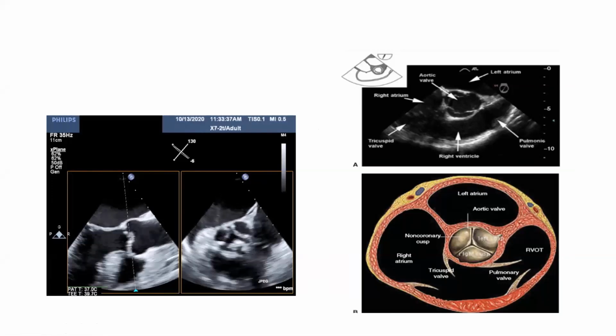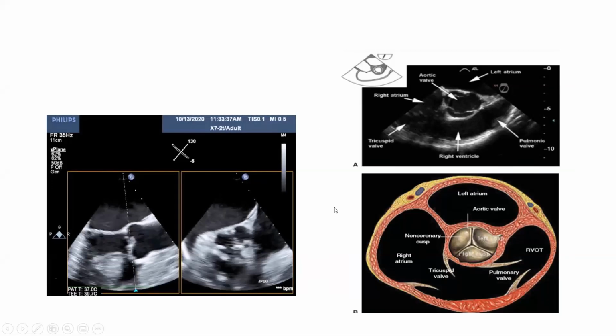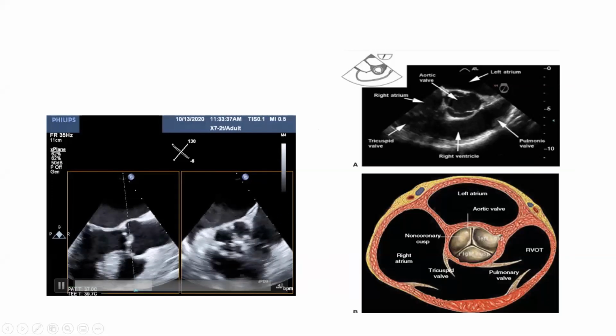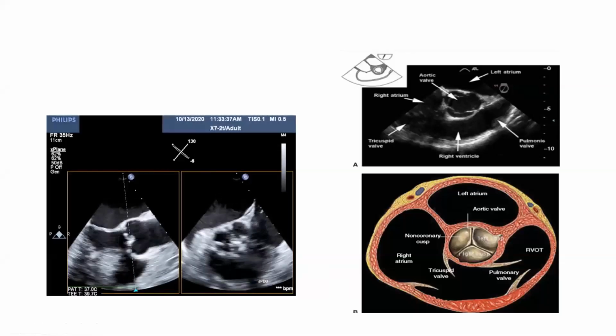You will go to the short axis of the aortic valve. So this is the second way to get the short axis of the aortic valve, and you get the tricuspid inflow and outflow, the pulmonary. Okay, so two ways: either you take the long axis, put X-plane, and get the short axis, or you go down to 30 to 40 or 45, and then clockwise rotation to get the anterior structure, and here's the aortic valve.